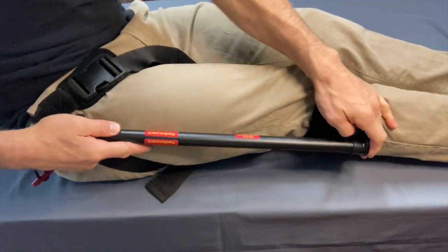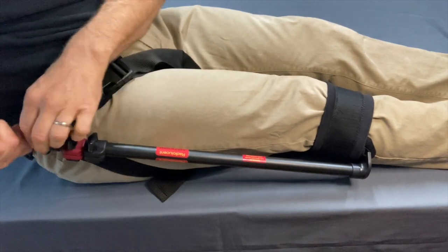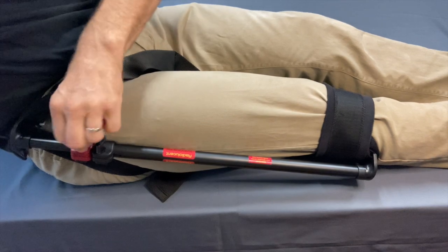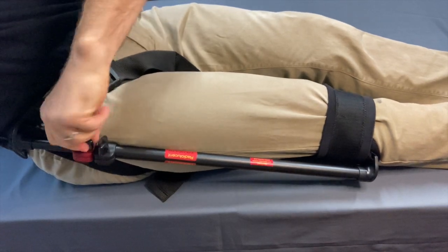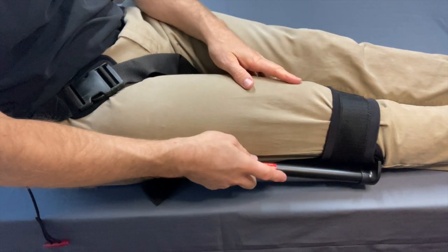In my case right now it fits perfect just like this. Loosen this a bit and give it a gentle tug until the patient says, "Ah, that feels better." Then tighten it up — and there it is. There's femoral traction.